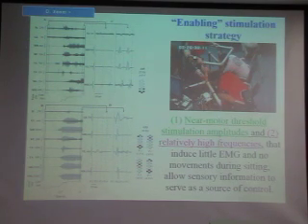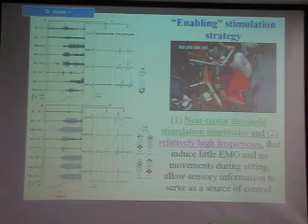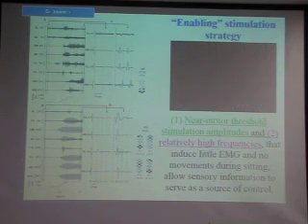So the point is that with appropriate stimulation parameters, and we are talking about this in a bit, the sensory information related to this transition from sitting to standing drives the spinal circuitry to generate motor patterns sufficient for standing.